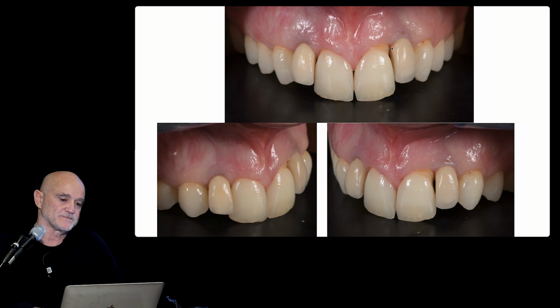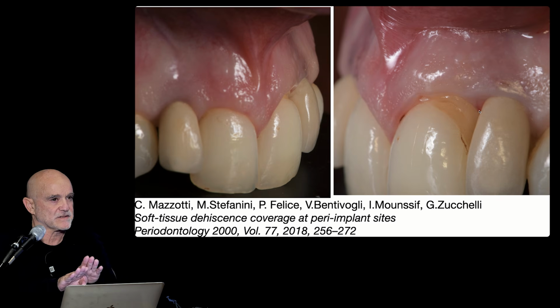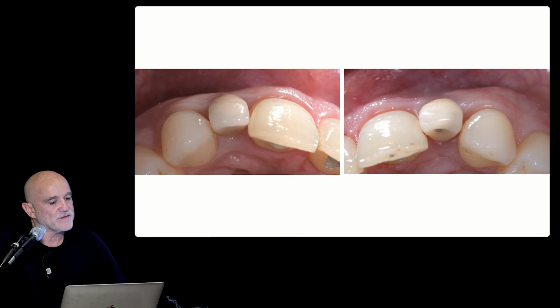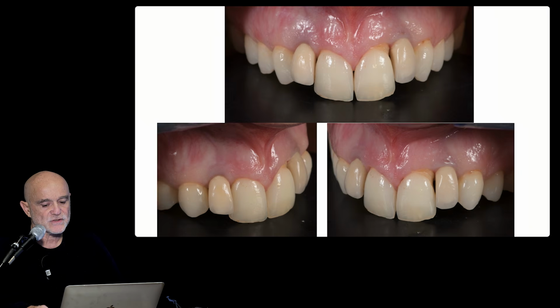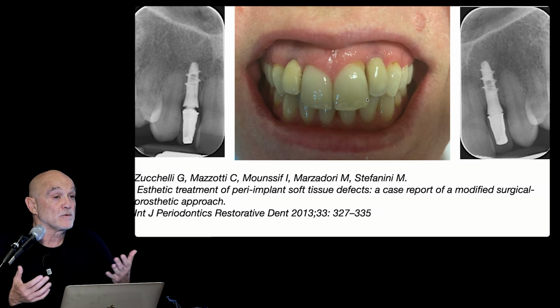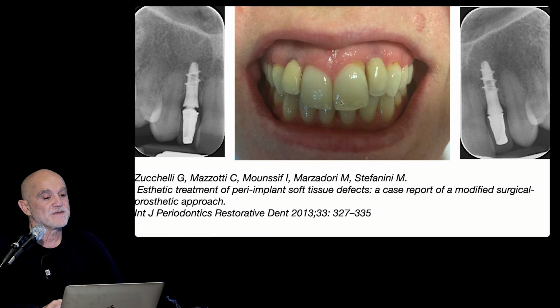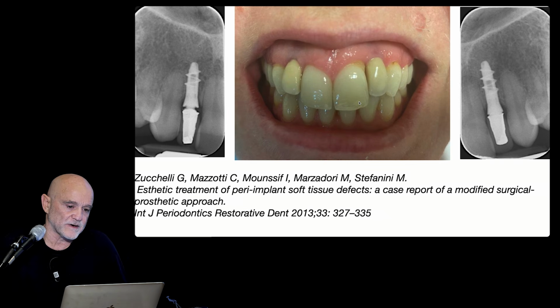In this case, the implant and the tooth are attached. But the implant, we can remove the crown. And the tooth, since we have a lot of extrusion of the two centrals. You see how much these teeth extrude, and this is very bad in the patient's mind. We have to sacrifice some of the central that needs to be covered with some veneering.